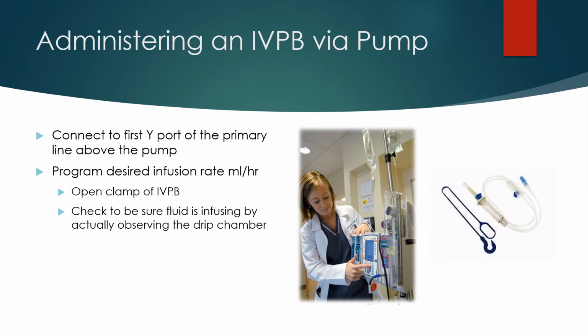When you attach your secondary bag to the pump, you prime the tubing, you connect it to the first Y port. You can see set the pump to administer the secondary medication, and then when it completes, it will revert back to the primary solution. Remember, we don't want to discontinue our fluids, then blood's going to back up, coagulate, and make that IV go bad.